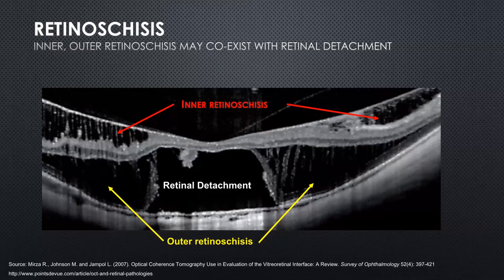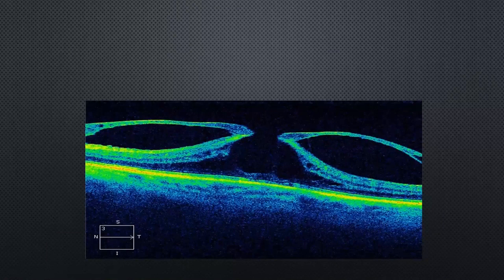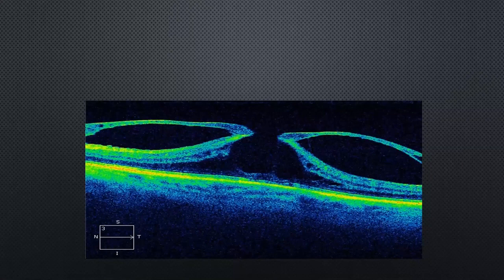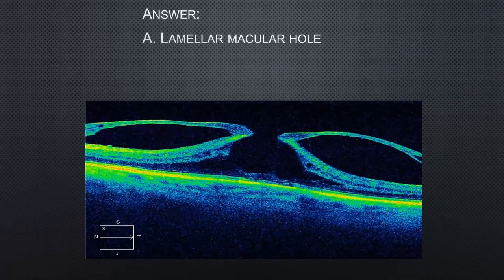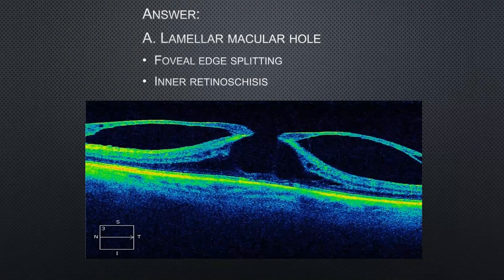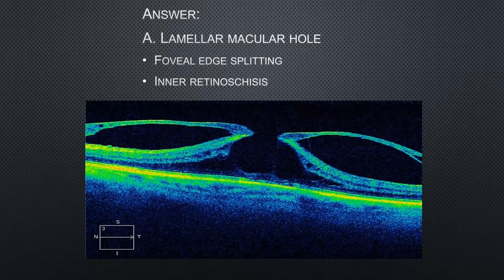Going back to that first picture — yes, that is a schisis. But it's more than just schisis: there is also a lamellar macular hole because of the splitting of the retinal layer. And since it is inner retinal schisis — the outer retina is not involved — the full answer for that picture is inner retinal schisis and lamellar macular hole.